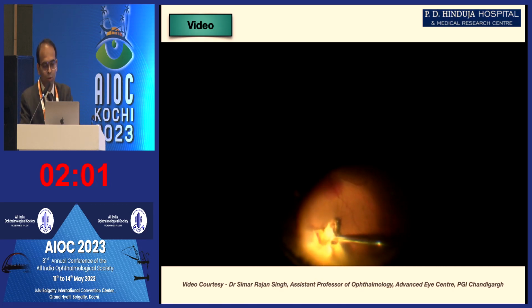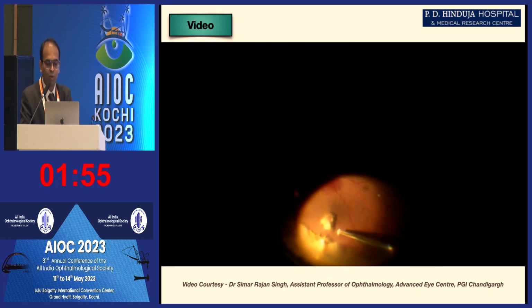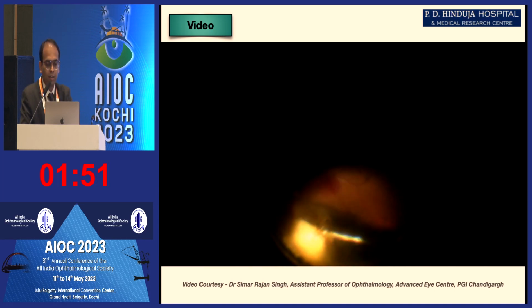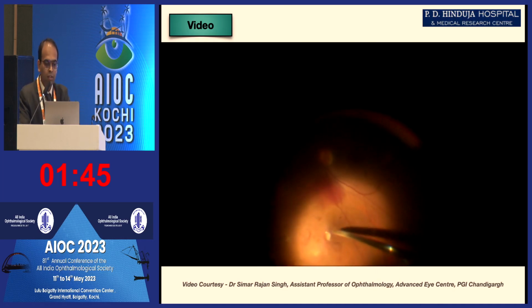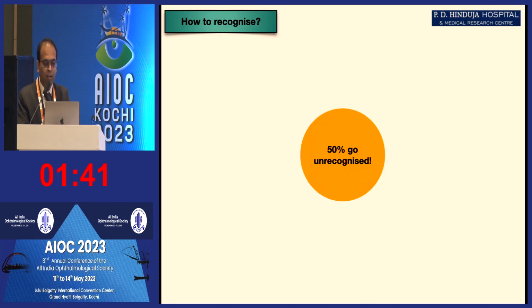And in most of these cases, there will not be a retinal detachment because once the needle perforates there will be retinochoroidal adhesion, and that's a good adhesion, in fact. Once that is done, laser is applied to that area and fluid exchange. So 50% of breaks will go undetected.